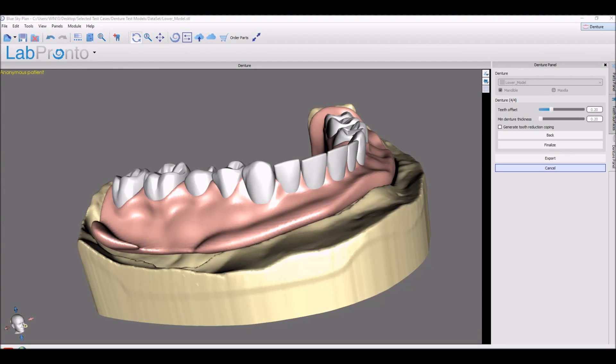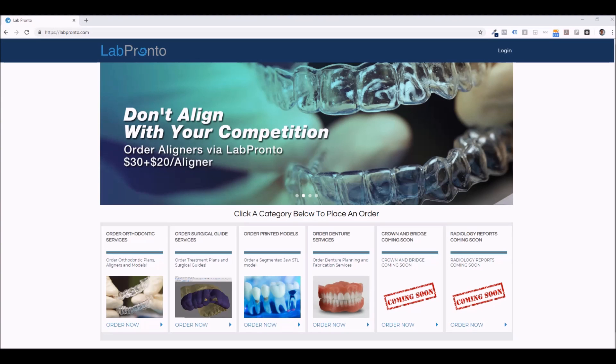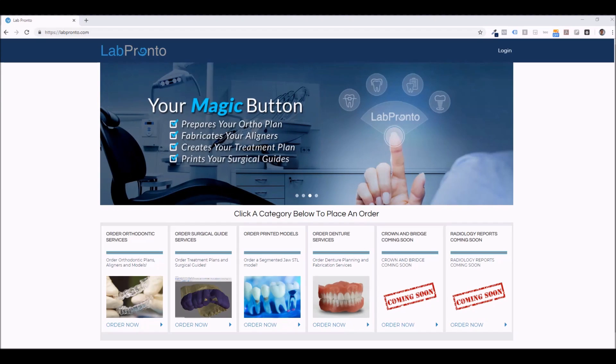And lastly, there's now a full bridge from the CareStream software to BlueSkyPlan. So if you've acquired data through a CareStream CT, you can now push the data. And if you placed any implants, you could push the implants directly from the CareStream software to BlueSkyPlan with a click. Speaking about clicks, don't forget LabPronto, LabPronto.com. Get it done with a click.